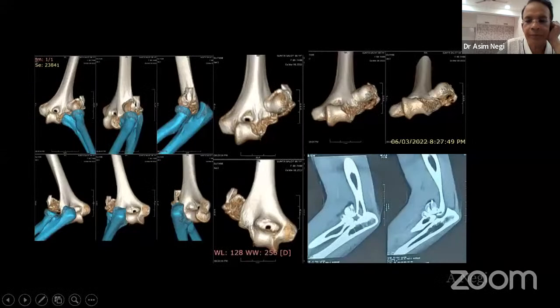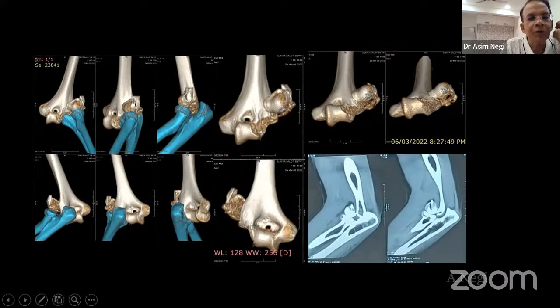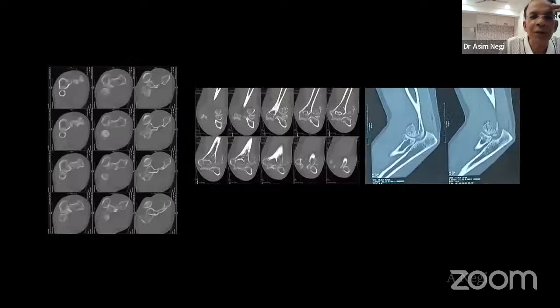So she is 55, female, fall from a scooty. She is a school teacher, I think. Fresh fracture was sent to me around day 4 or 5. No neurovascular damage. So this was the injury. These were the scan images. We couldn't get better images. She came with this scan, so whatever processing we could do, that is all we had. The elbow is obviously dislocated. This piece is probably coming from the capitulum, and the radial head also is fractured, as you can see in these images. And this is the capitular piece. So the CT wasn't as great as we would like it to be, but we had to manage with this.